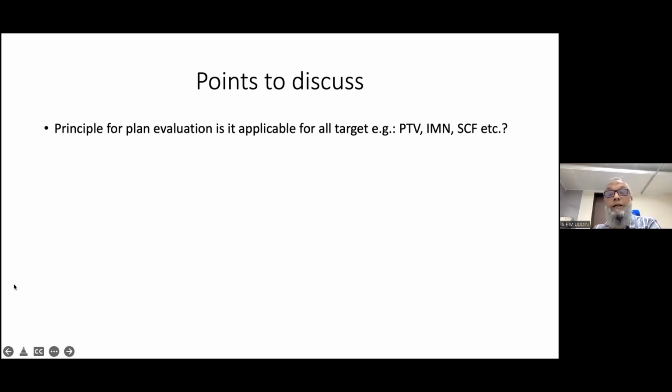So the answer is that for breast cancer, actually, if it is not RNI, still 3D with tangent is the best for whole breast. When there is RNI, the challenge comes, and then we bring up the field in field forward IMRT, and for better coverage we go for inverse planning. Gradually, we move from forward IMRT to VMAT, and nothing is free, as he was showing. When we are reducing the heart and lung dose, we are buying some risk to the contralateral breast.